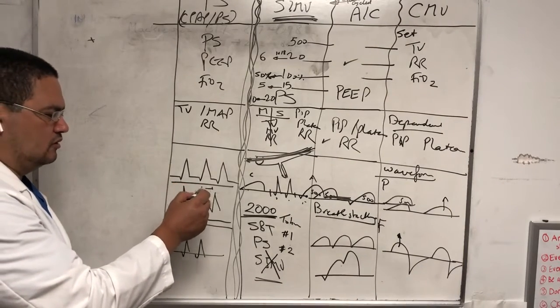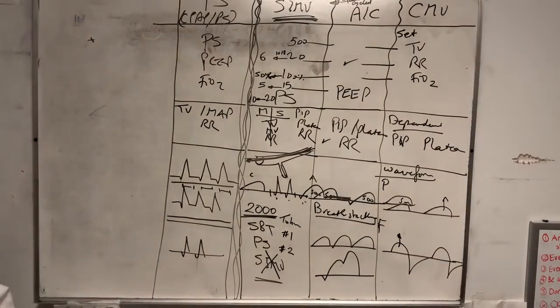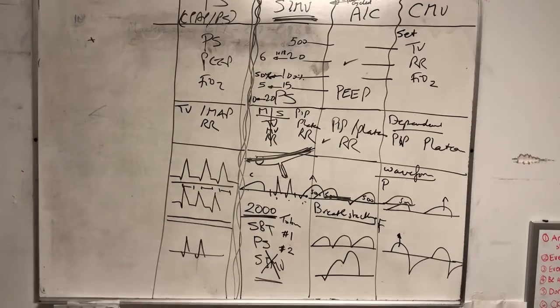Also, the breath is short. There's minimal control over the time of the breath. The patient finishes the breath, as opposed to this one, for example, right? So the breath is short.